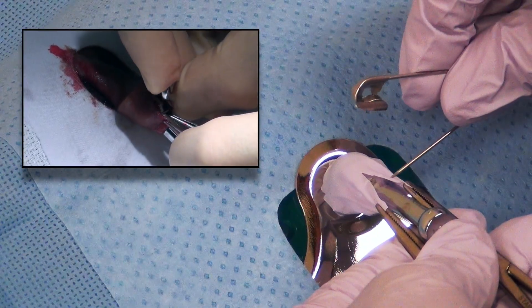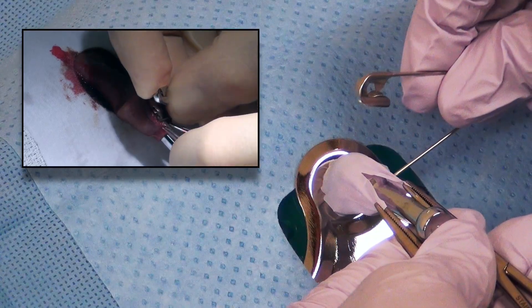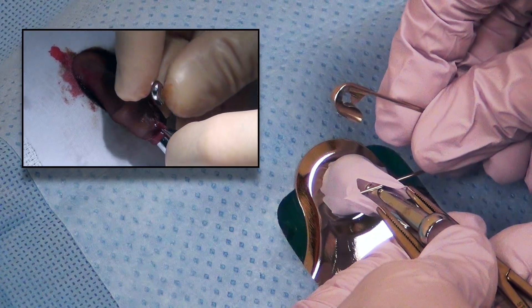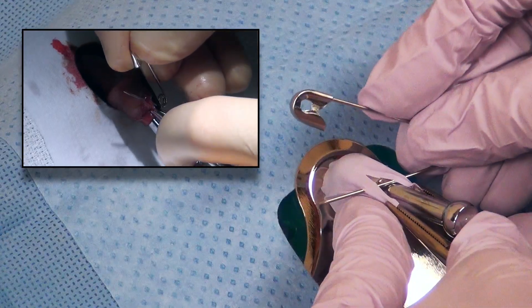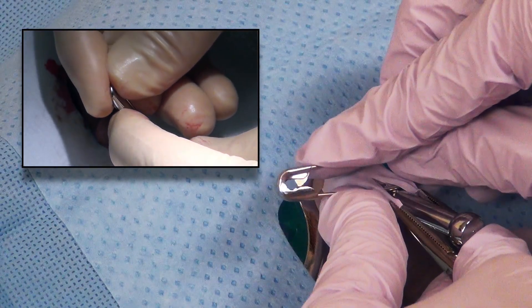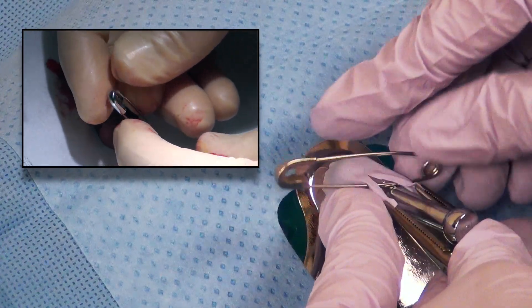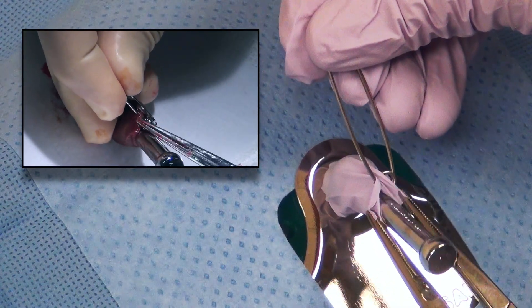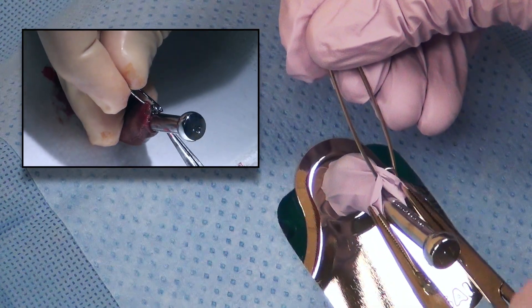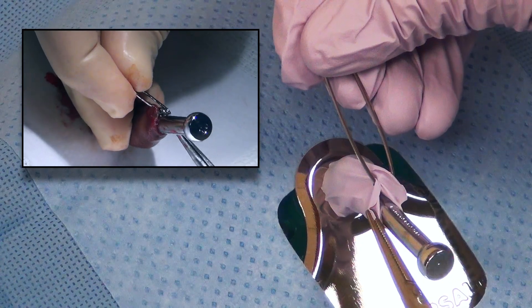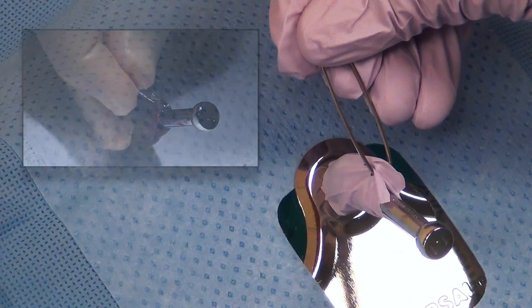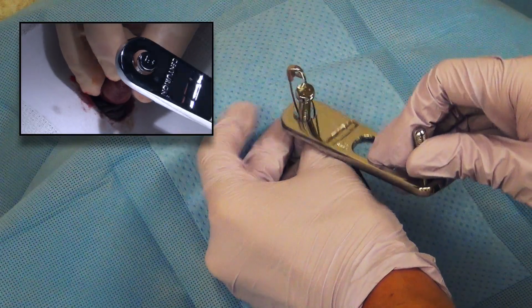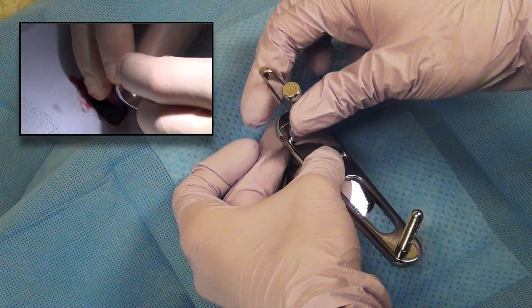Alternately, a sterile safety pin can be used to secure the foreskin over the bell. The bell and safety pin can then be pulled through the hole in the base of the Gomco clamp.